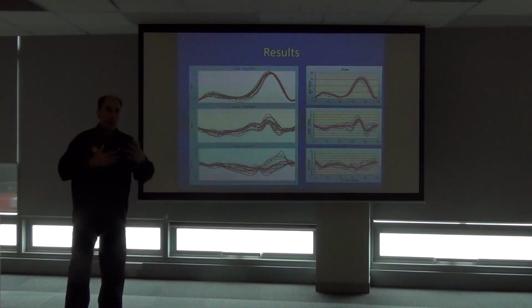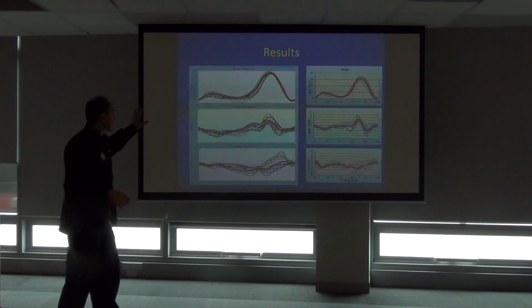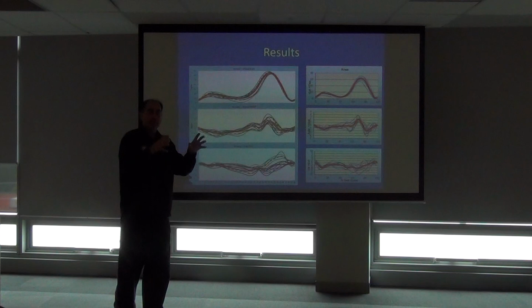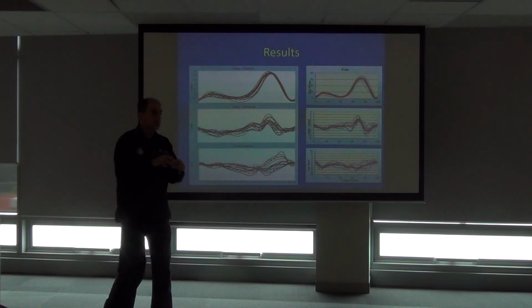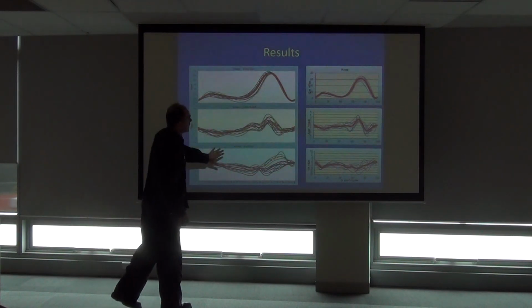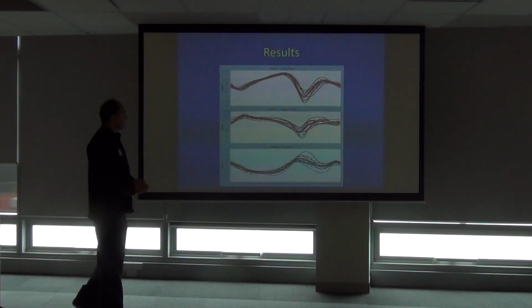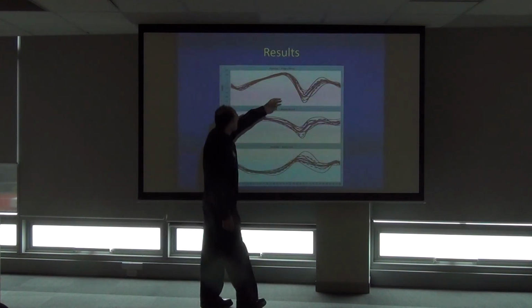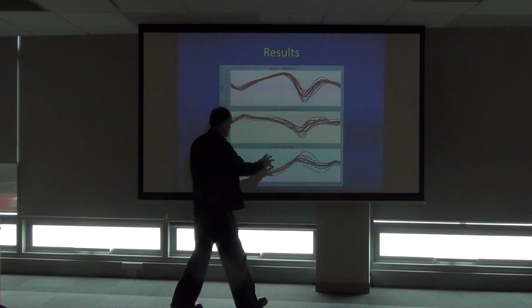So there appears to be, within walking, even though you've got some characteristic patterns, some subdivisions within that of increased or decreased flexion extension, abduction adduction, or internal external rotation. So some patterns within it. Again, it's speculative. It's just something I noticed when analysing the data. And ankle, again, not so obvious in ankle, but there is some separation above and below the mean. Not quite so obvious in the ankle.